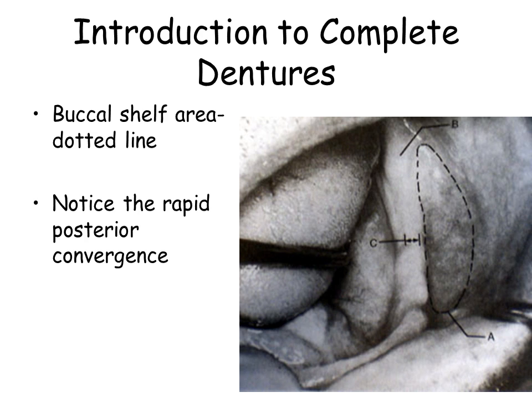The denture should cover completely the buccal shelf. The terminus must converge rapidly to avoid displacement by the contracting masseter. This muscle is activated and recorded in the functional impression by exerting a downward force while asking the patient to close.